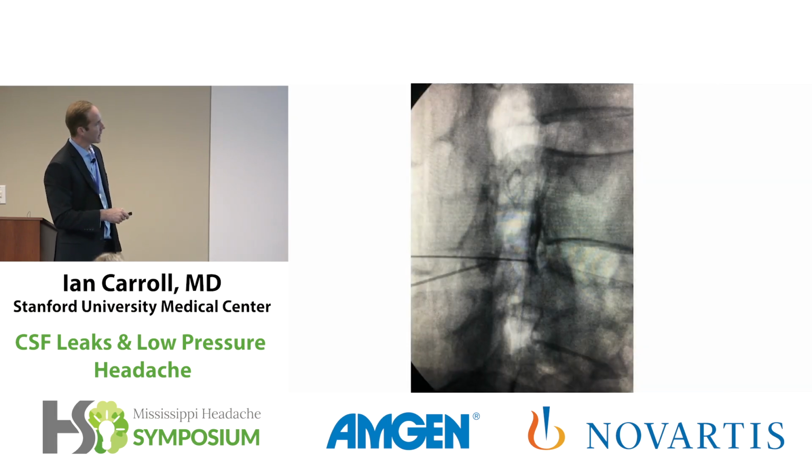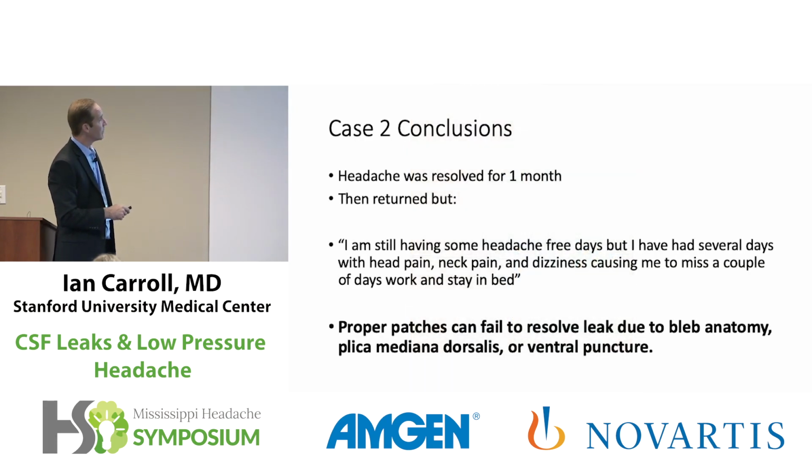And this is what it looks like on a lateral. Here's the vertebral column. The disc is here. And you can see now, with this needle coming in the foramen, I get all the way to the front of the epidural space, which is here. And you can see the contrast outlining the back surface of the disc because I'm in the front of the epidural space. All right?